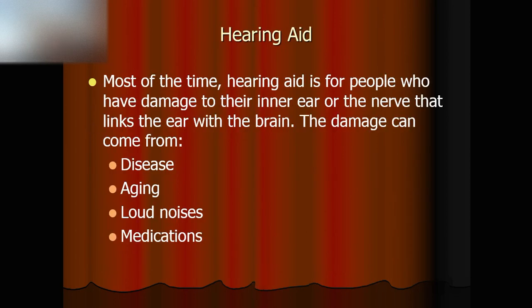Most of the time, a hearing aid is for people who have damage to their inner ears or the nerves that connect the inner ear to the brain. The reasons for the damage can be disease, aging, for example, especially above 55, loud noises.